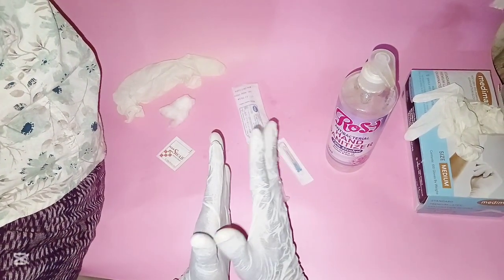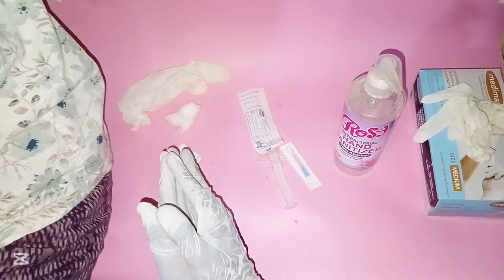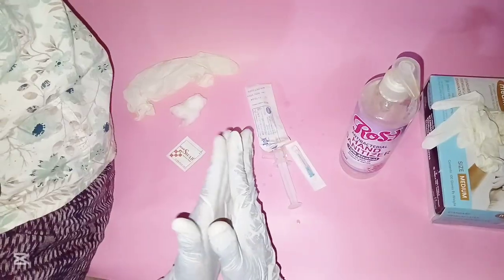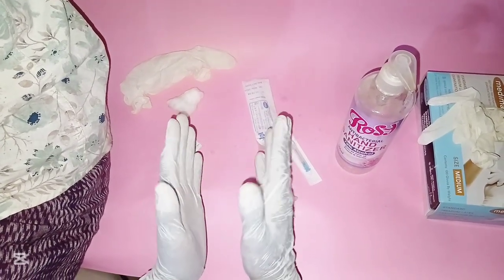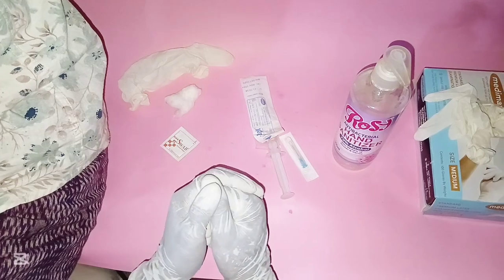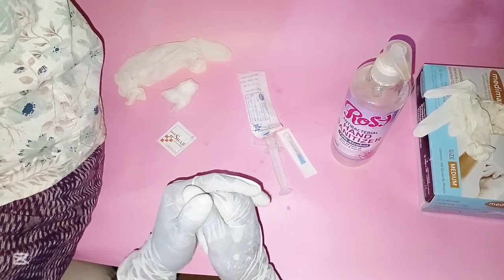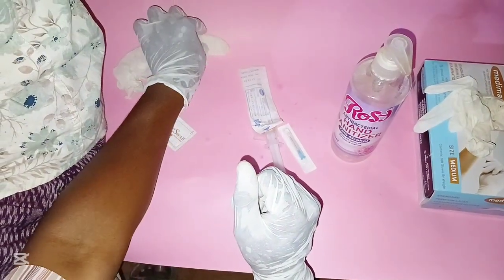Place the drug beside the patient's bed and label it with the drug name. Before administering, ensure you have followed the eight rights of drug administration: right patient, right drug, right route, right dose, right time, right reason, and right documentation.